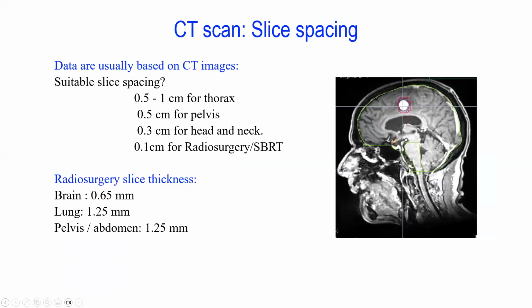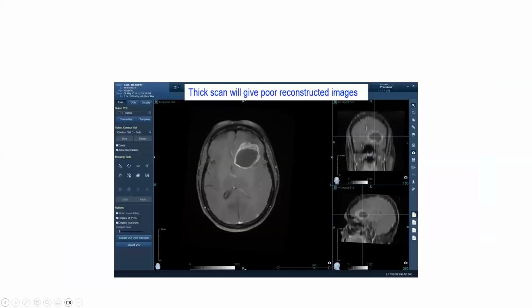Now, when we talk about this radiation facility, what actually happens is we need to do an MRI, PET scan. Ultimately, we are treating on CT scan, so we need to do an appropriate CT scan. If you don't do a proper planning scan and don't have a proper MRI, we will not just see this.